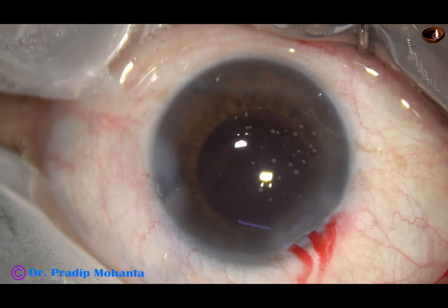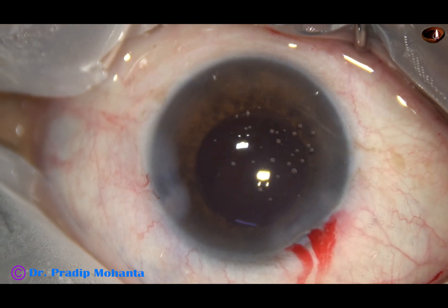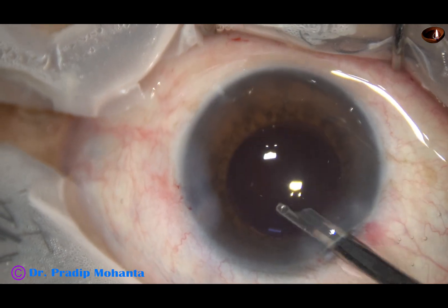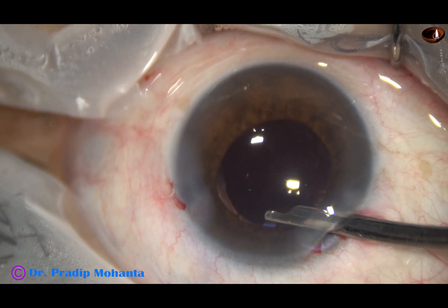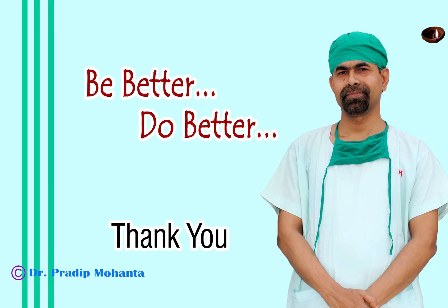The side port is closed by corneal stromal hydration. And now this is the final lavage of the anterior chamber. The anterior chamber is then nicely formed and the case is concluded. Thank you very much for your attention. Hope this video will help you in developing your surgical skills. Be a great surgeon and serve your patients with love, respect, empathy, and great surgical competence.